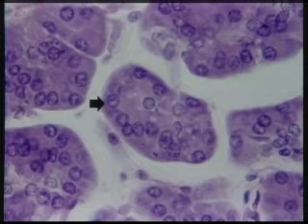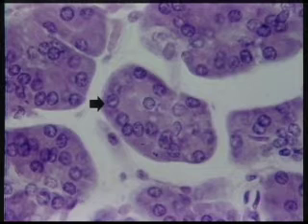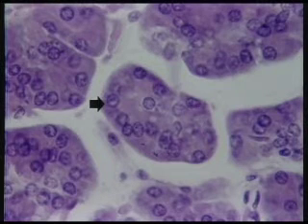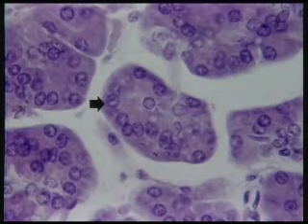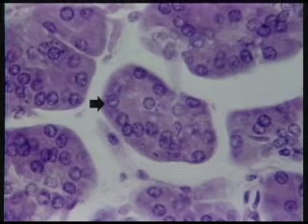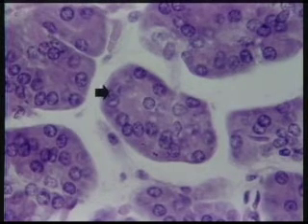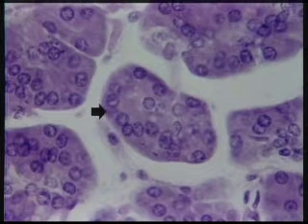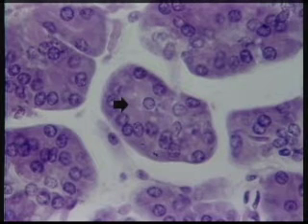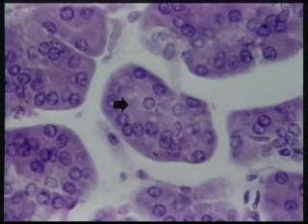And it's commonly used because it has a very nice characteristic. Some things stain purple with it, some things stain red. In the dye, the hematoxylin is purple and the eosin is red, so certain cell components attract the hematoxylin. Now, hematoxylin is a basic dye, so acidic things in the cell, like, for example, the ribosomes of the rough endoplasmic reticulum, tend to attract it. So in this pancreatic acinar cell, you have lots of rough ER located at the base, and it's going to stain purple with hematoxylin. The secretory granules, which are in the apical part of the cell here, stain red with eosin. They're somewhat basic, and so they attract the eosin, which is an acidic dye.